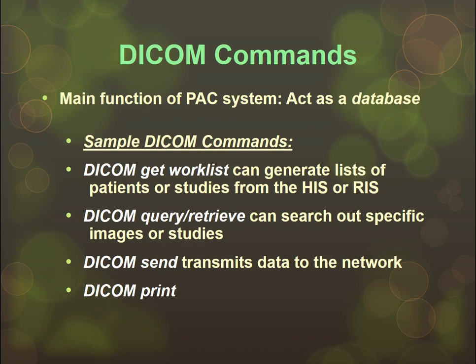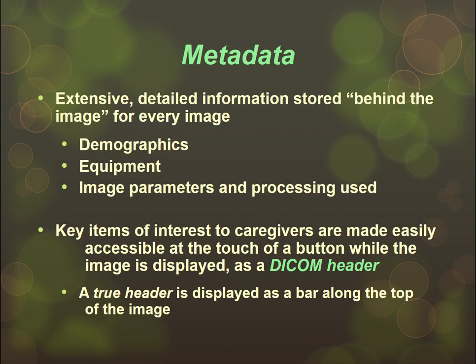DICOM commands. Don't get DICOM commands confused with DICOM functions. DICOM commands are go and do things, right? They involve actions. You're going to do a query. You're going to go find something. You're going to do a DICOM retrieve. You're going to go bring it back. You're going to send something. You're going to print something. You're going to get a work list. So when you think of a command, think of go and do. So don't get those confused with DICOM functions, which we'll talk about in a few minutes.